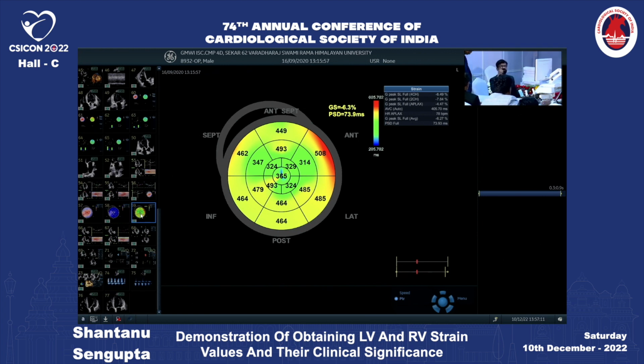Yeah, you have a question. We can do the septolateral delay and everything. There is something called the myocardial work index, which we can surely talk about, but that's slightly on the higher side. And there's a guy called Russell who had worked on this concept of the efficiency of the heart.